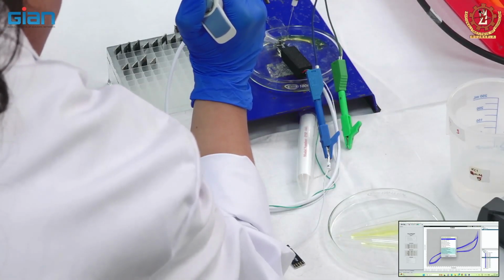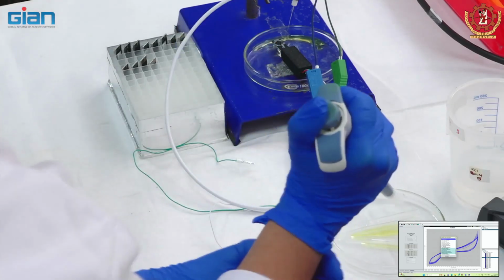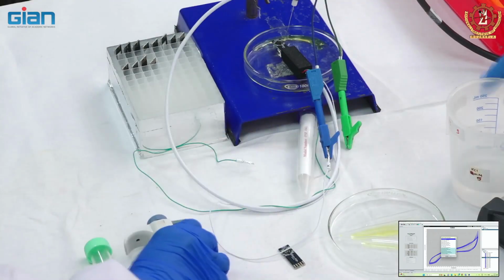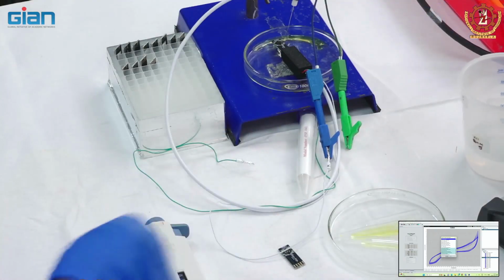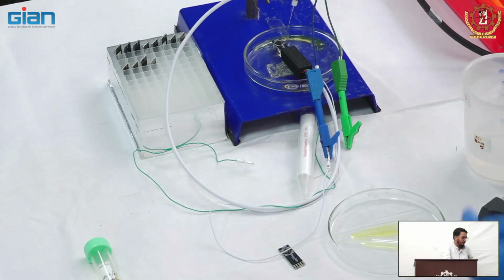Can we switch the screen? The lab? Yeah. So, we will go for washing. Yeah.